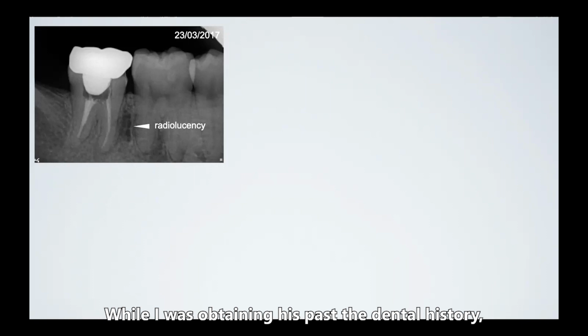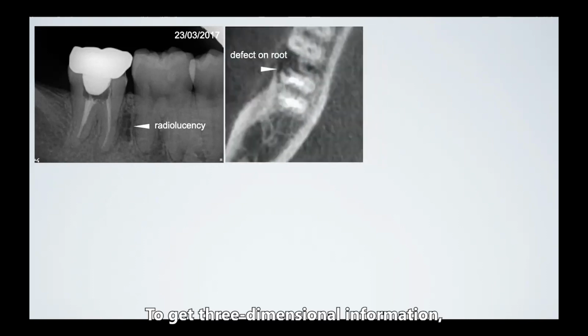While I was obtaining his past dental history, I learned he had orthodontic treatment with a mini screw for anchorage. To get three-dimensional information, CBCT scans were obtained, and the defect was found on the mesial root surface. Obviously, it was due to the damage done by the orthodontic screw.